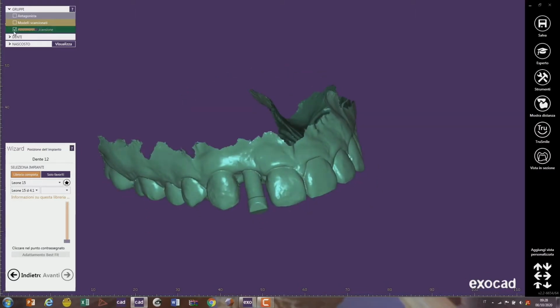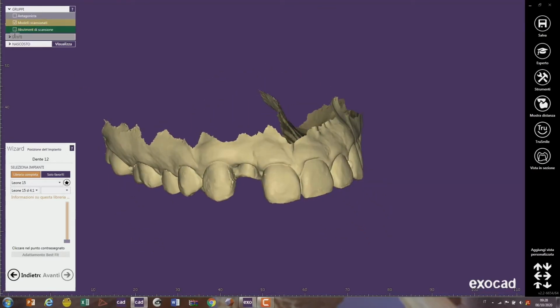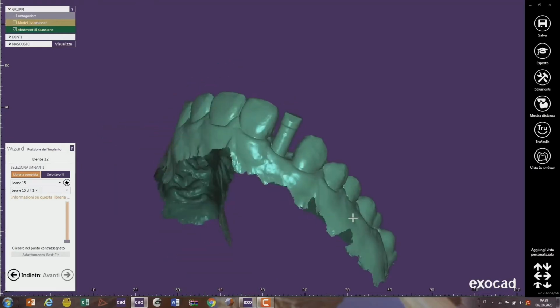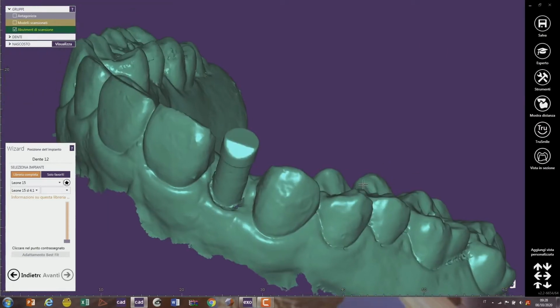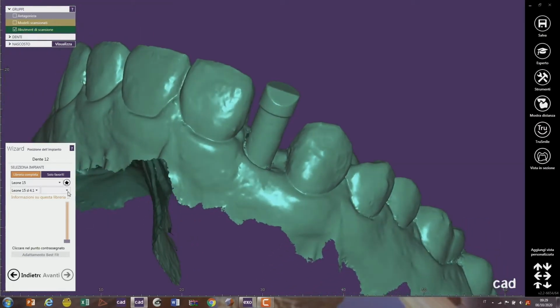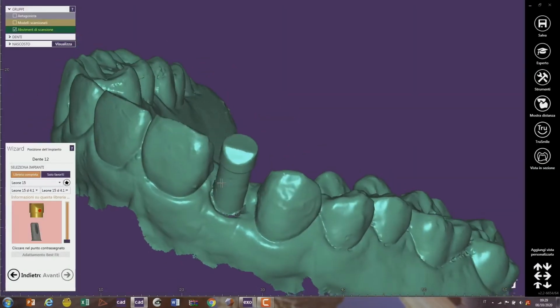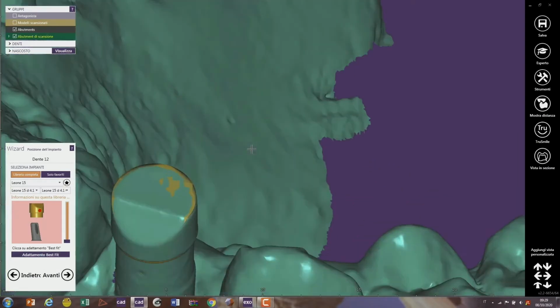Basically the dentist sent to the dental technician some STL files, the master model with the mucosal color, the antagonist, and then the master model with the scan body in position. It is a mesh. Then the dental technician replaces only the scan body mesh with the corresponding library file. And it is quite important, because we have much more definition, and the dental technician can model on perfect margins, but it's very important that the position is the same.